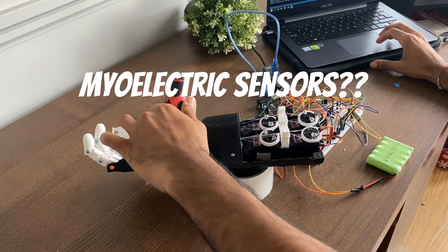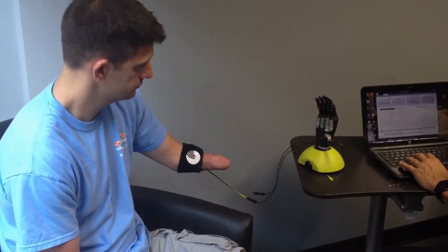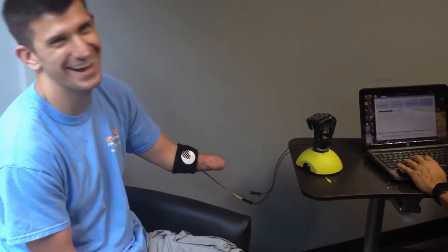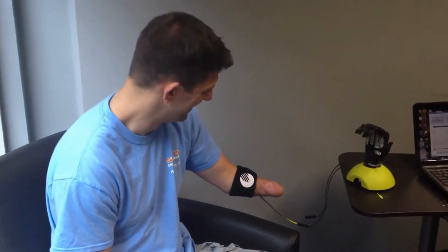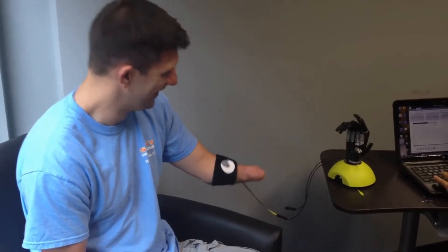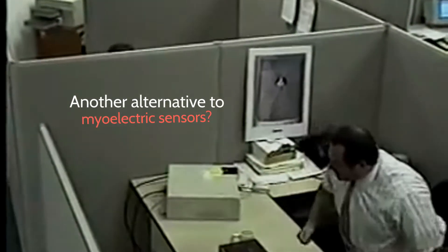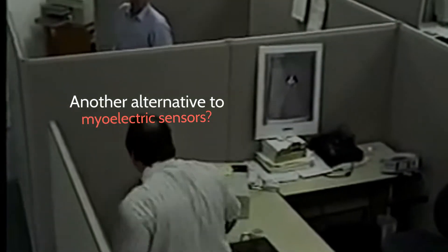Myoelectric — what? That's probably a question you have. A myoelectric sensor is something that's used to detect muscle movements in the residual limb of an amputee, and then use that movement and convert it into signals to basically get the arm to move. That's the high-level explanation. Obviously there are many complexities associated with myoelectric sensors, but all that adds to the cost of the prosthetic arm — and that's probably for another video — but that's one of the reasons why the arm is really expensive.